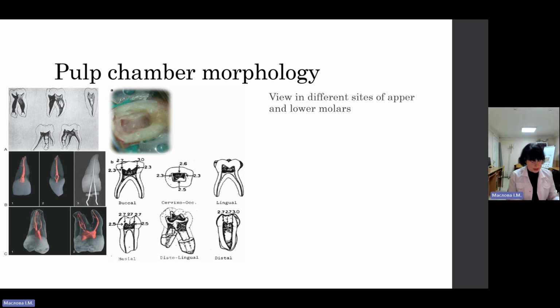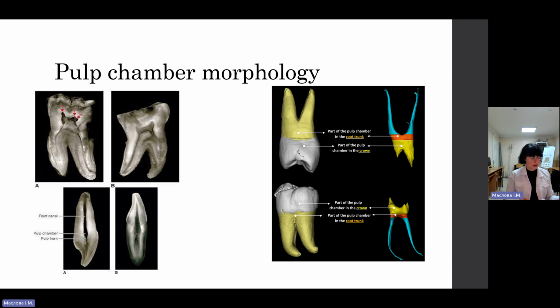Endodontic access openings, incisor and canine teeth. Incisors and canines have one root and one root canal. The access cavities for maxillary central and lateral incisors are similar and generally triangular in shape. Access cavities for maxillary and mandibular canines are almost identical and more ovoid in shape. Access for mandibular central and lateral incisors is triangular in shape, and a second canal may be present in 40%. In general, extend the access in these teeth toward the incisal edge.